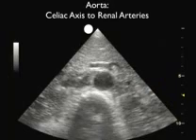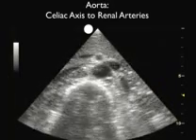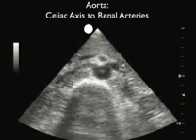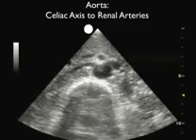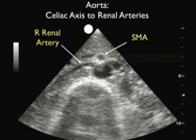So let's reinforce the proximal branches of the aorta with this video clip. We see the hyperechoic spine and the aorta on top. There's the celiac axis or seagull sign, and there's the SMA coming off with a hyperechoic or bright rim. So celiac to SMA, and we'll go ahead and freeze that image down, and we see the splenic vein arching anterior to the SMA. Notice in this video clip we actually catch the right renal artery coming off just to the side of the aorta, branching over towards the patient's right side towards the IVC.